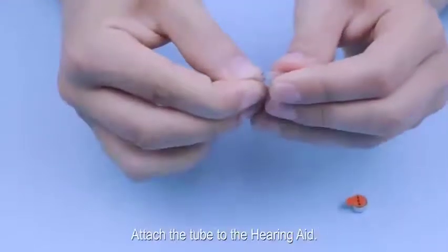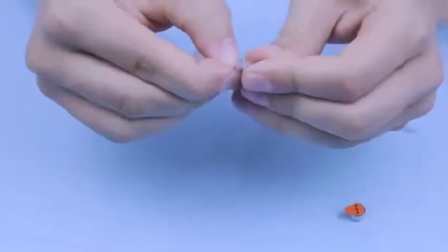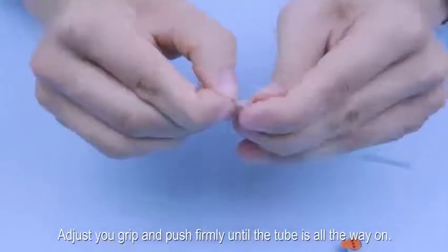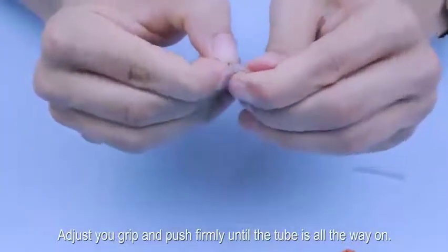Attach the tube to the hearing aid. Adjust your grip and push firmly until the tube is all the way on.